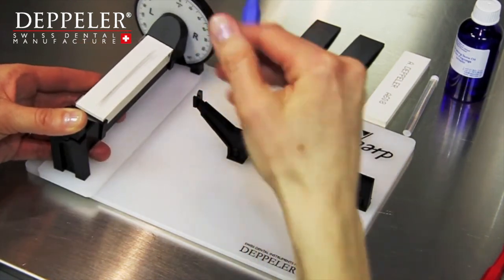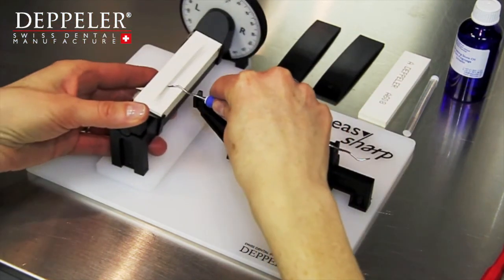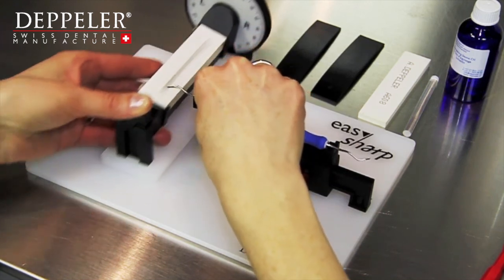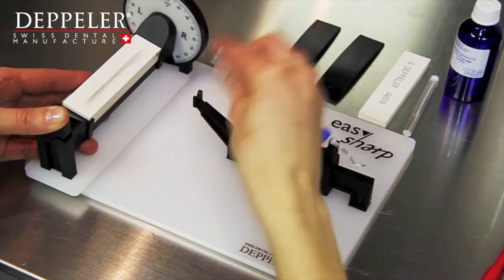Thanks to the EasySharp appliance, your instruments will be as good as new until the end of their life cycle. Try it — you'll be able to appreciate your instruments longer.